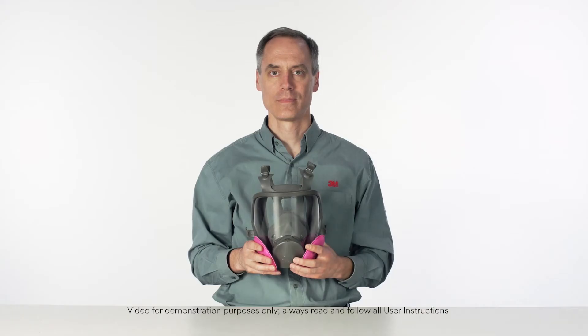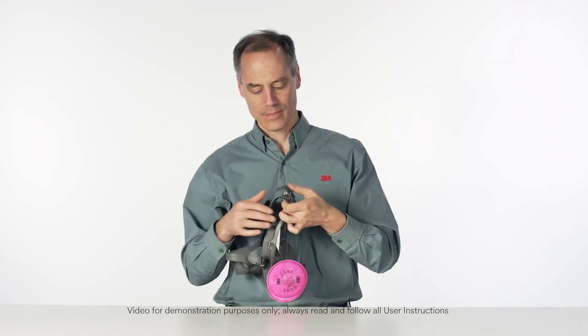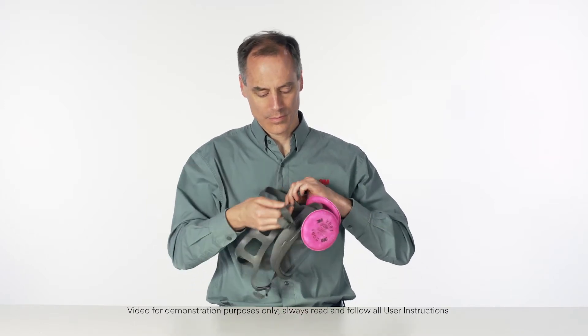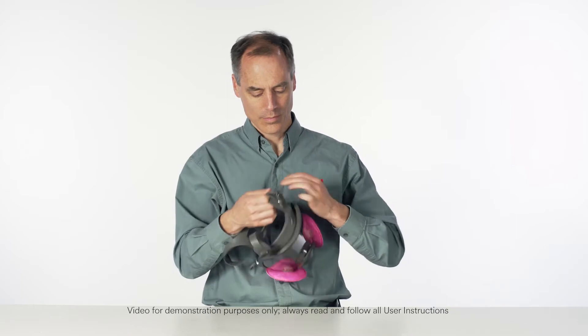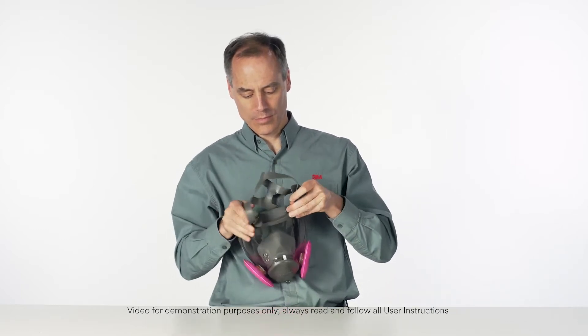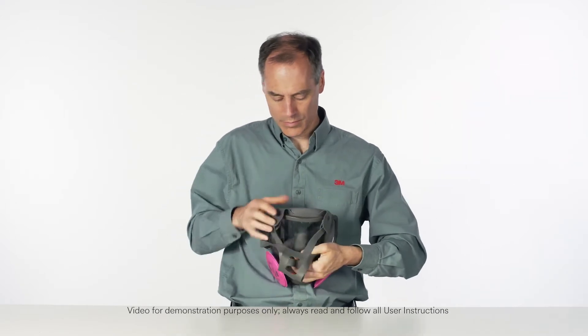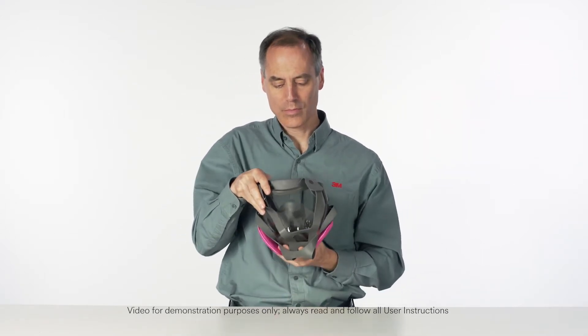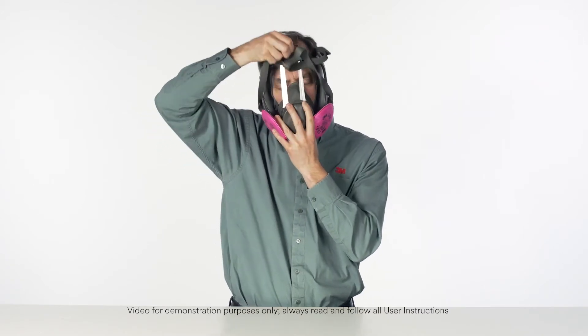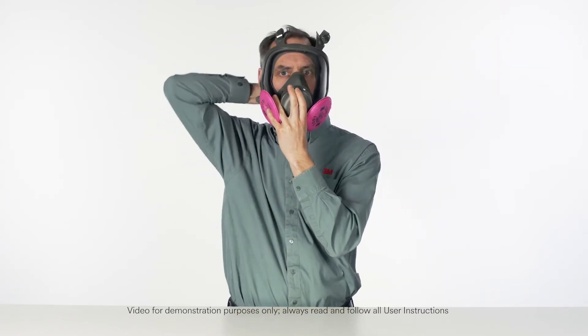Fully loosen all four head straps. Position straps over the front of the facepiece. Pull your hair back with one hand. Bring the facepiece up to your face with the other hand. While holding the facepiece in place, pull the straps over your head.